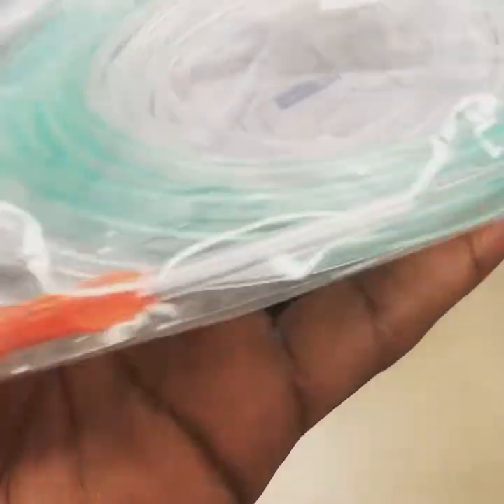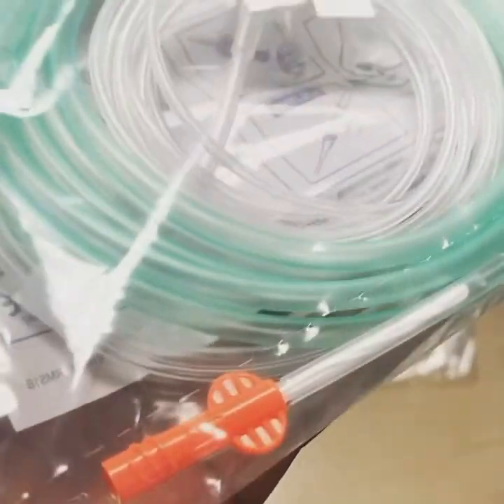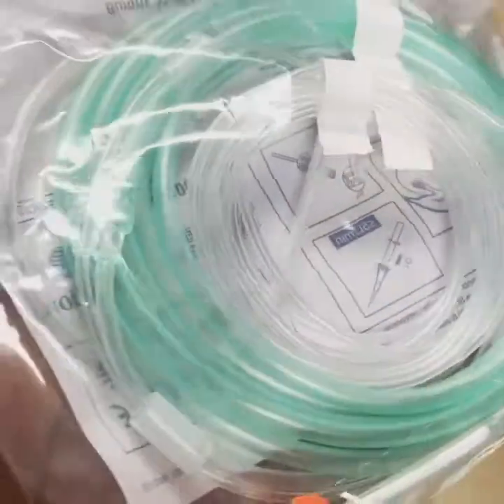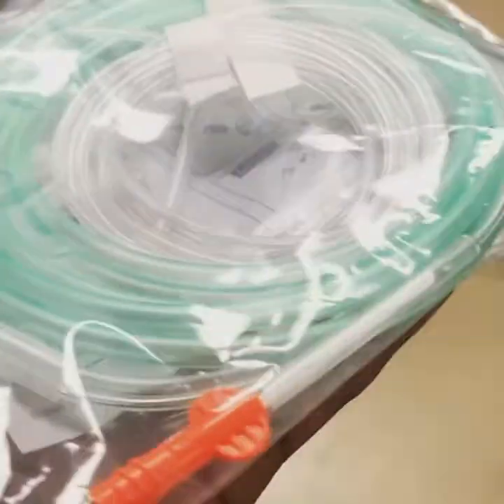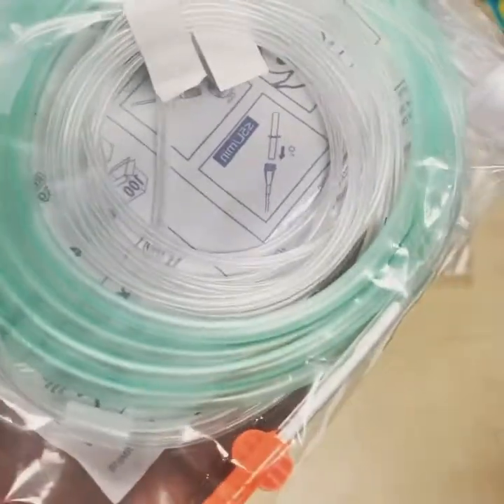This piece right here goes into our end-tidal CO2 detector, so as the patient exhales we can measure the amount of exhaled CO2. Just a regular nasal cannula setup, but it's beneficial because we have monitors in the emergency department that allow us to connect this piece to the interface for the end-tidal CO2 reading.